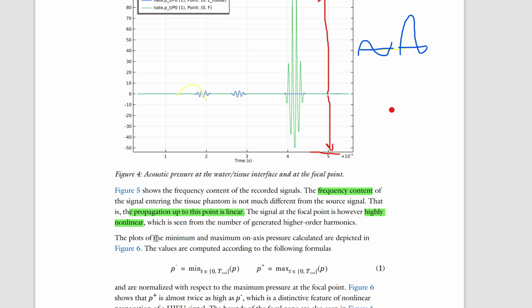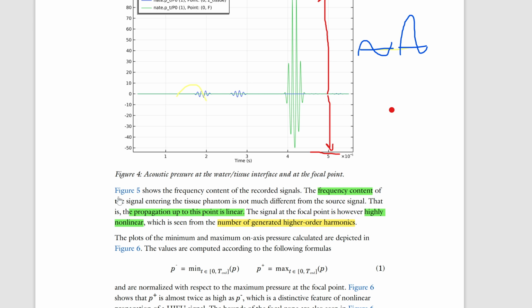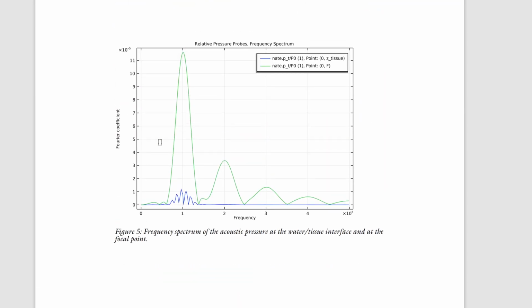The plot of the minimum and maximum on-axis pressure calculated are depicted in Figure 6. So actually, let's see. Figure 5. Oh, okay. Let's go to Figure 5. And we can see these highly nonlinear by the number of generated higher order harmonics. Let's go there. Figure 5.